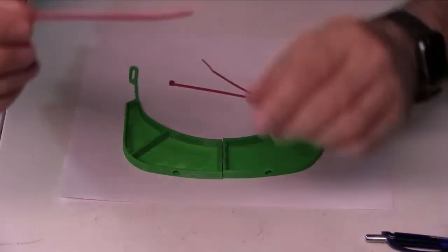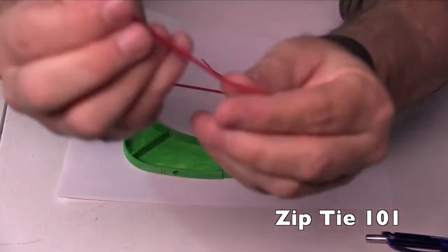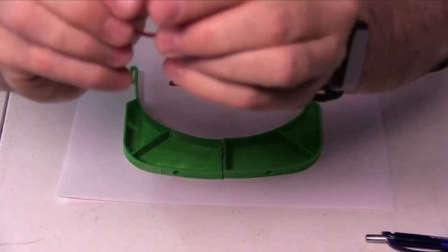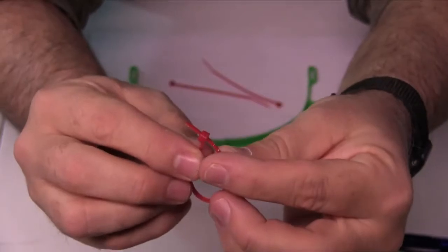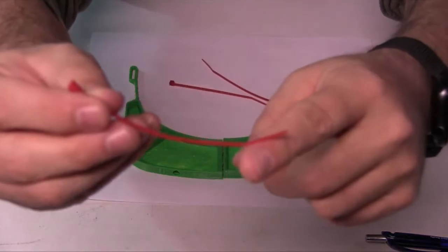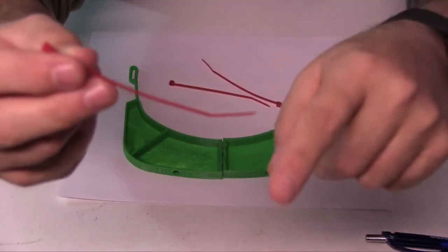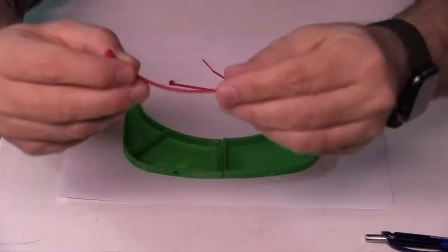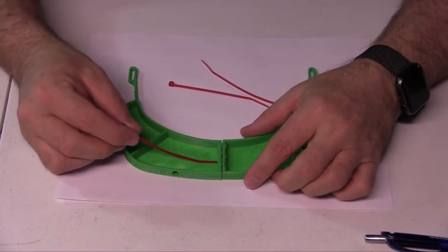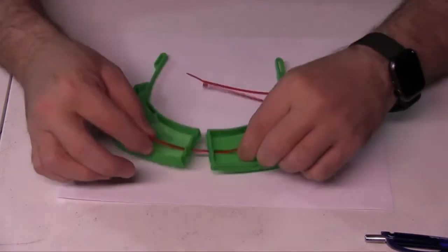Make sure that your zip tie is formatted so that the actual zip tie will go through and it will lock in place there. You have to experiment with that, but usually it comes with a little bit of a lift right there. It's bent up a little bit to show you that that goes around that way. So I usually start with the middle one and I put it through here, and you'll see that it's now connecting these two pieces here.